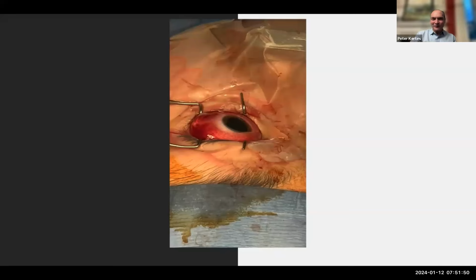And Rajiv, timing wise, presumably you've done some more, but compared to a regular scleral buckle, how does this take longer? Does it take less time? Yeah, I would guess longer, it's a little longer. It's probably 5 to 10 minutes longer than it takes me, so not much longer, but it's longer for sure. It's a little bit more of a pain in the butt.